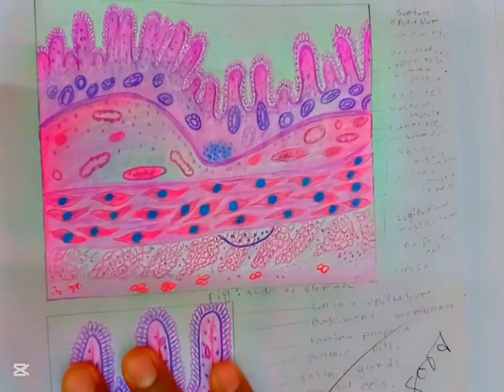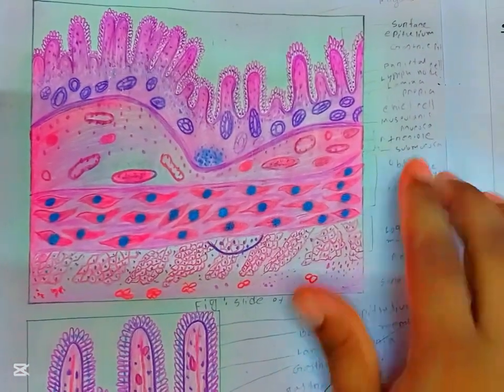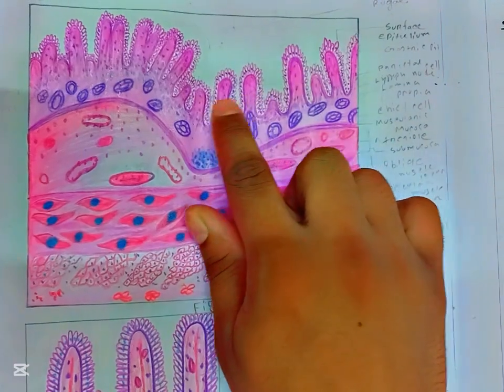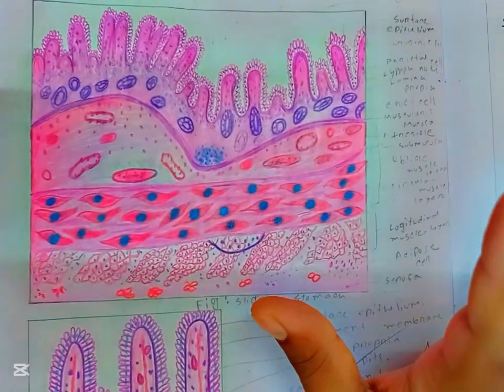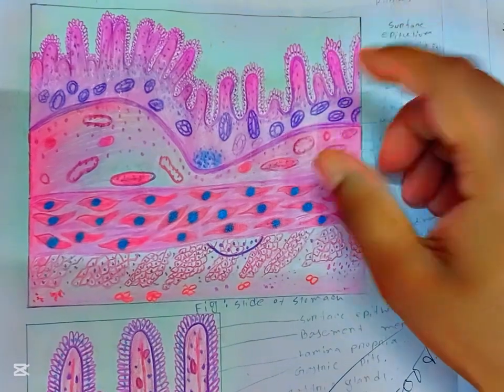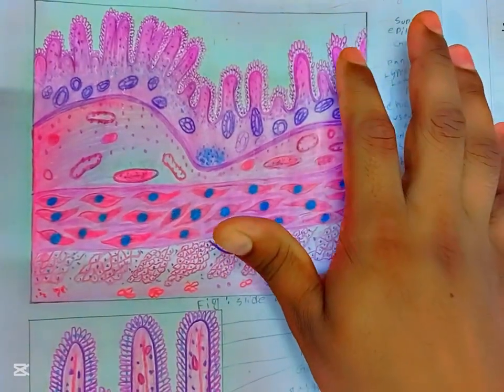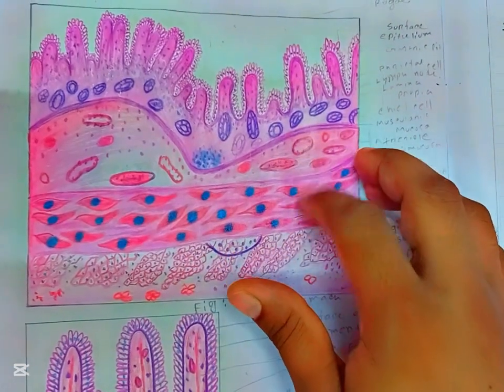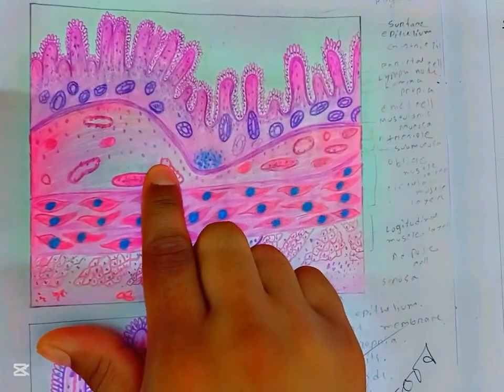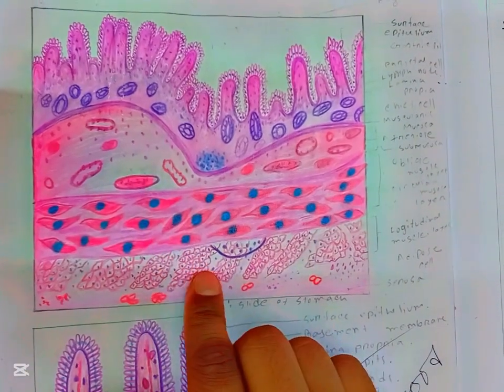Then this is the histological figure of stomach. The stomach is lined by simple columnar epithelium, and there are also 4 layers: mucosa, submucosa, muscularis externa, and serosa. Lining epithelium, simple columnar epithelium, then the muscle pattern of the muscularis externa: inner oblique, middle circular, and outer longitudinal, and this is the serosa.